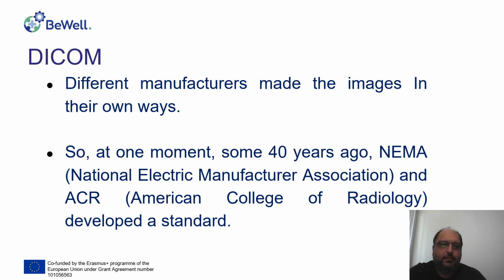What is the history behind DICOM? In the past, the different manufacturers had different methods to create the images, and they were not compatible. So imagine you have devices from different manufacturers. The images are not compatible with each other, and it is very difficult to have them all at once or in the same place if you need to replace some device with another.